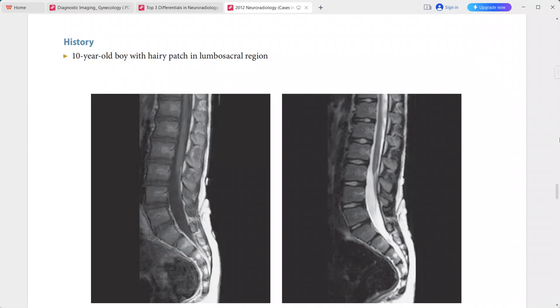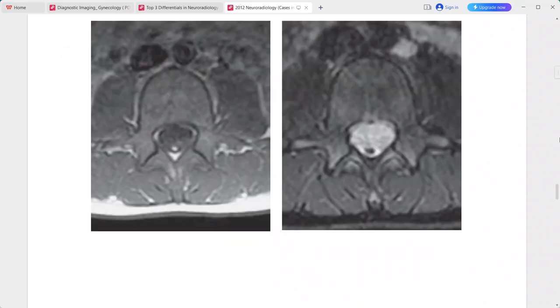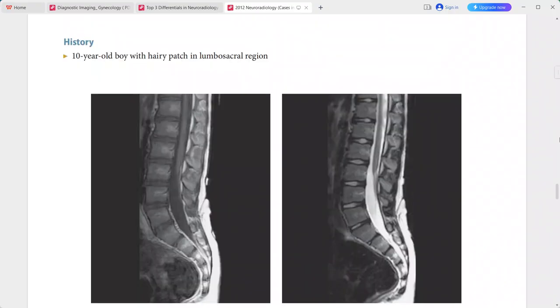Case of a 10-year-old boy presenting with a hairy patch in the lumbosacral region. The conus medullaris is terminating at the level of L3 vertebral body, which is lower than normal, consistent with tethered cord.